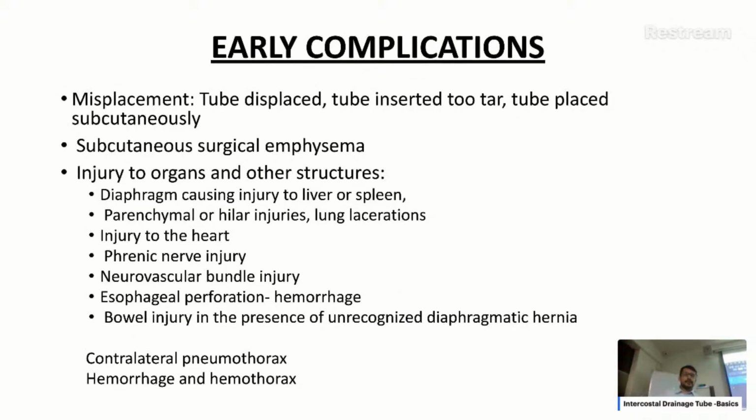Now complications while inserting ICD. It could be misplacement, tube could get displaced, tube inserted too far, tube placed subcutaneously. Subcutaneous surgical emphysema could also be there due to air leaking just beneath the sutures, just beneath the incision site, injury to the organ and other structures.